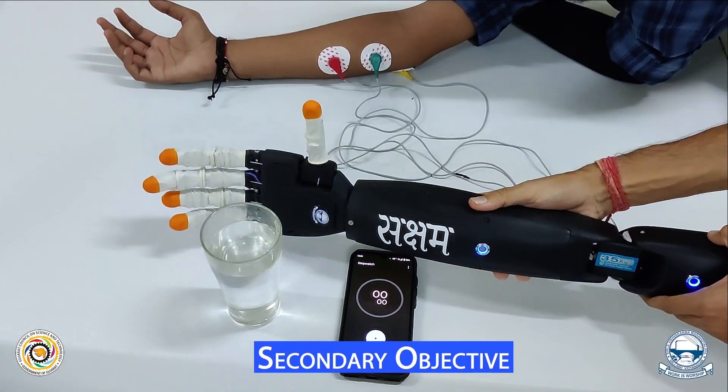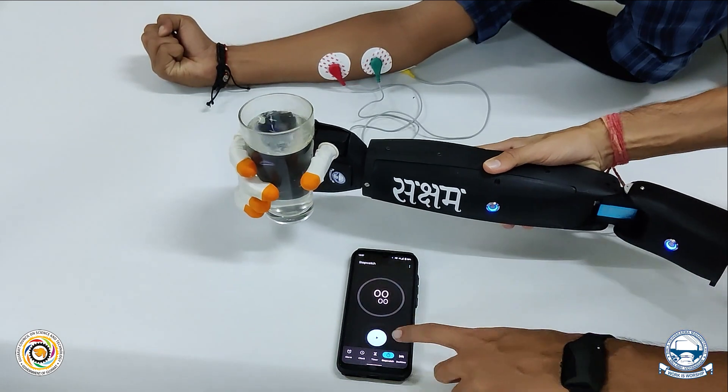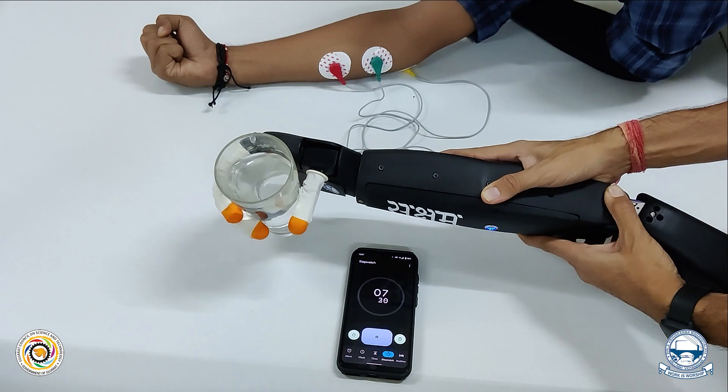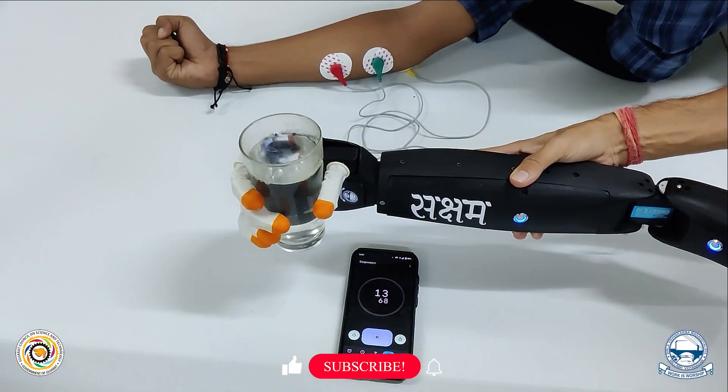The secondary objective is picking up at least a 400 ml glass filled with water, holding it up for one minute visibly above the surface, and putting it back down with no spilling of water in this process. There is no human intervention in the complete mechanical chain.